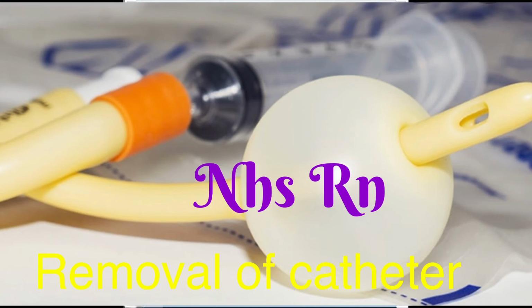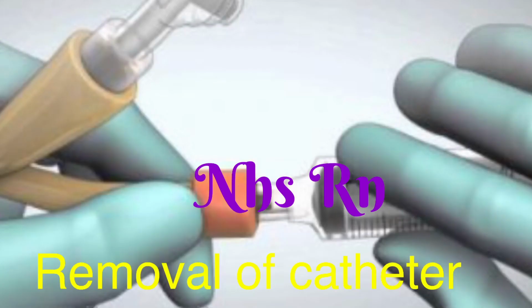So then tell the patient that I will uncover you minimally so that I can see the catheter. Is that okay? Okay, so you just uncover the patient minimally. Then you need to put on sterile gloves and apron, and be careful, you only expose the area required. Okay, the particular area, you can't remove all the sheets.